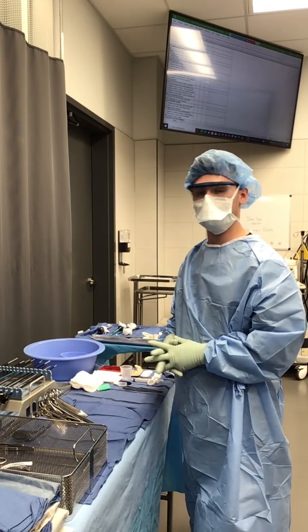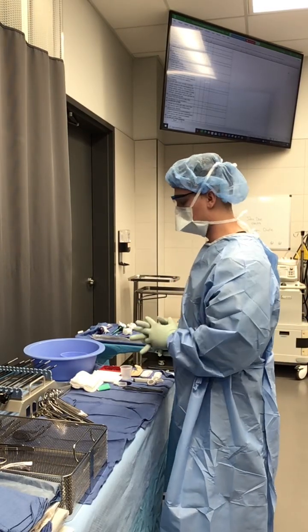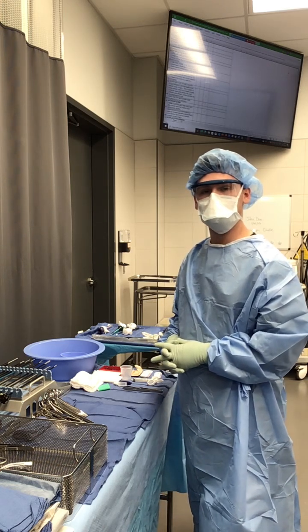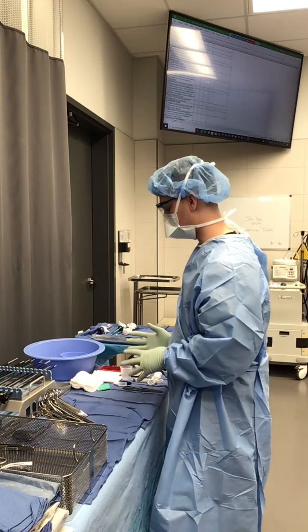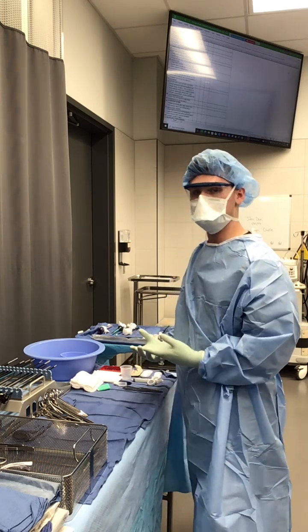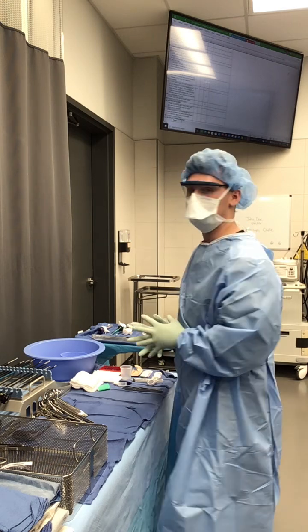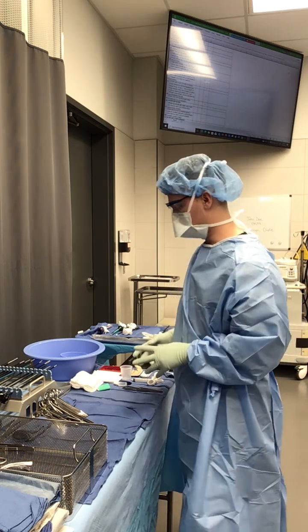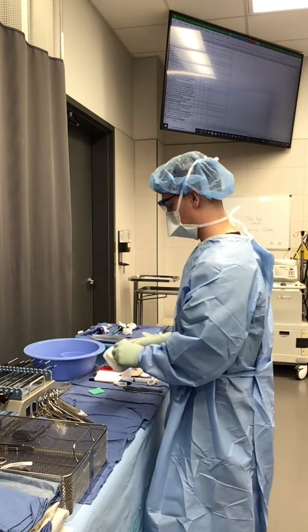All right, we're continuing forward. We've got our sterile field established, so I'm ready to go ahead and do my soft count. When doing a soft count, there's no instrumentation, so we're not using a count sheet. We're going to use a count board like you've seen or will see in clinicals. I'm going to ask my nurse: are you ready to count? Yes.